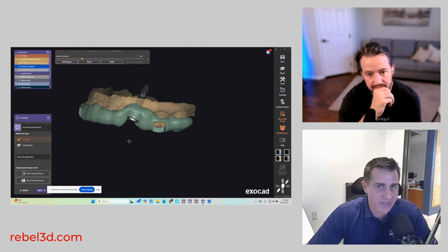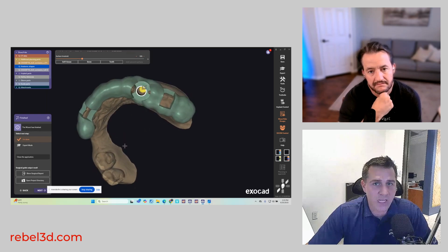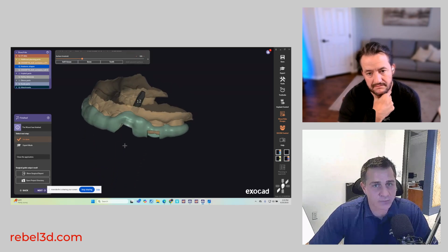It just starts to add up. And in today's dentistry, where a lot of providers are in contract with insurance companies, every dollar counts. So this right here can save you a lot, and you can get the treatment on the books faster because you know that I can get that guide planned and printed in a matter of 24 hours, and we can see them tomorrow.